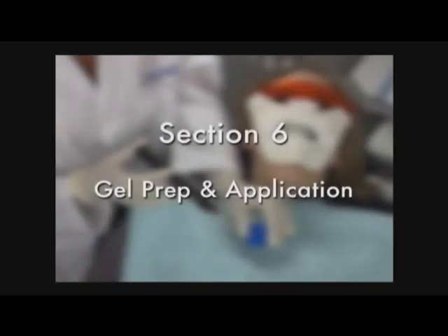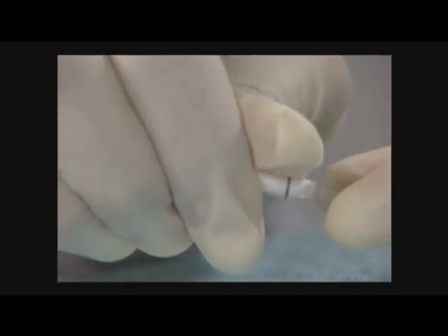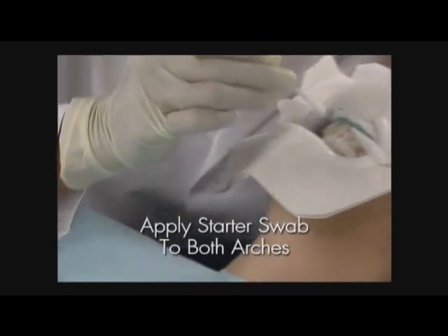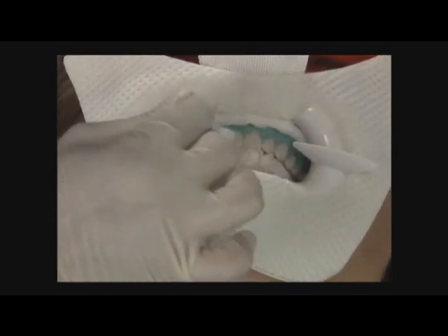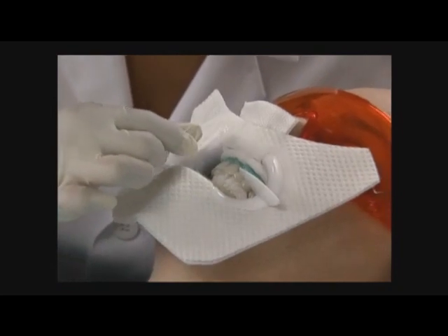Section 6. Gel prep and application. Break open the end of the swab applicator at the line to release the solution into the tip. Apply one swab to the top and bottom arch. The solution does not need to dry. The whitening gel may be applied immediately.